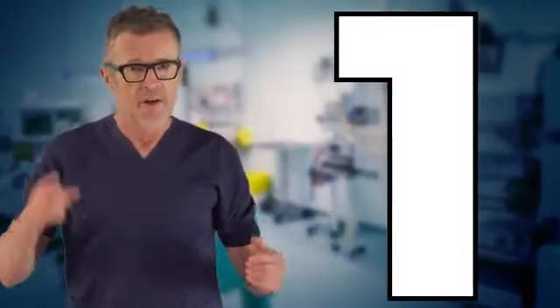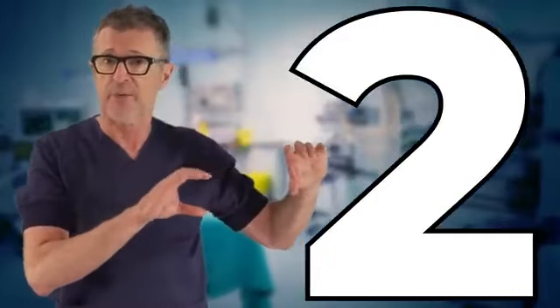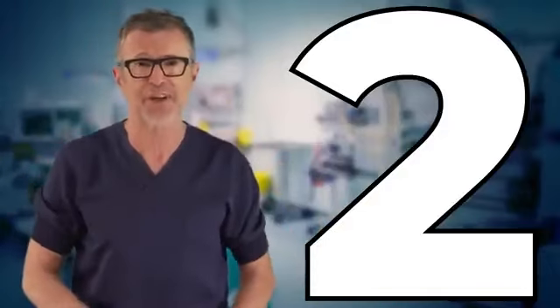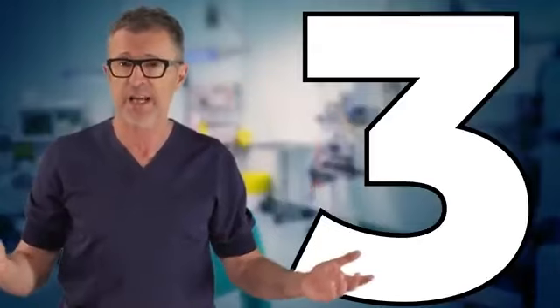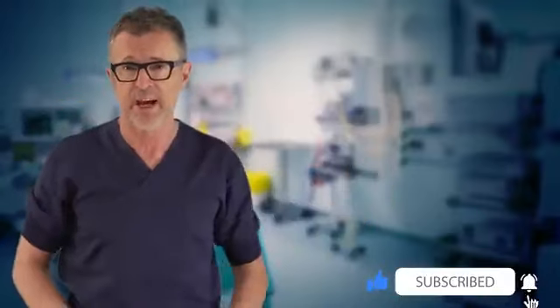And these are the three most common reasons why IV catheters fail. Reason number one, the catheter is too short. Number two, the catheter needle system was not placed long enough inside the lumen of the vein to allow for enough slack, so that the catheter does not migrate into the subcutaneous space. Reason number three, the angle of catheter needle system insertion is way too steep, and the operator does not have a chance to correct it and advance it sufficiently long inside the lumen of the vein.